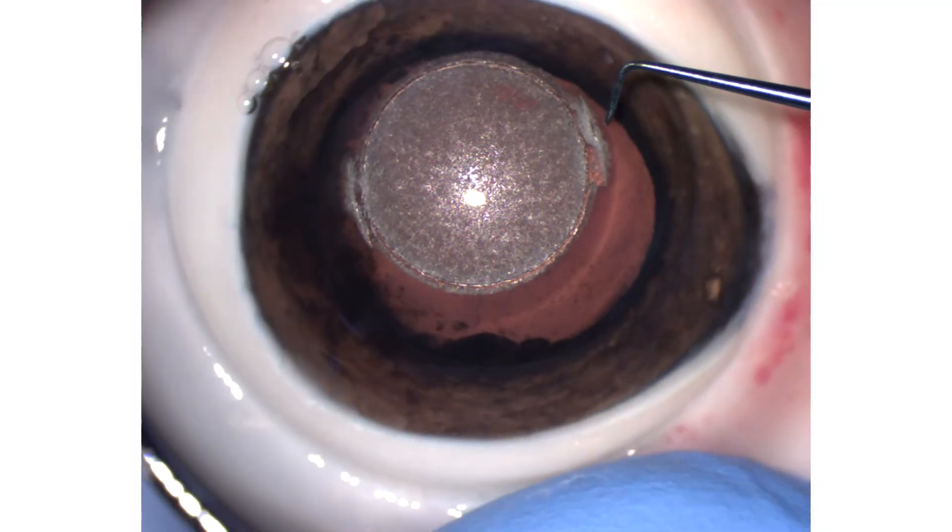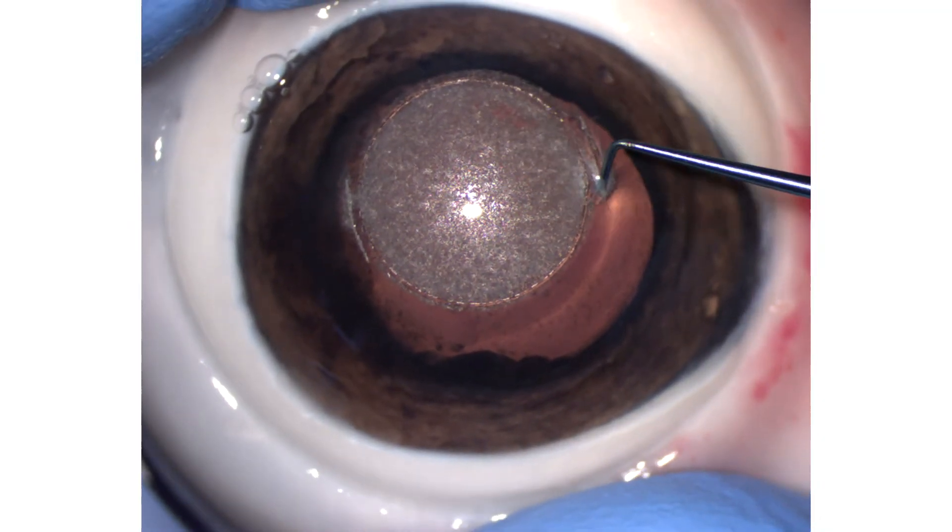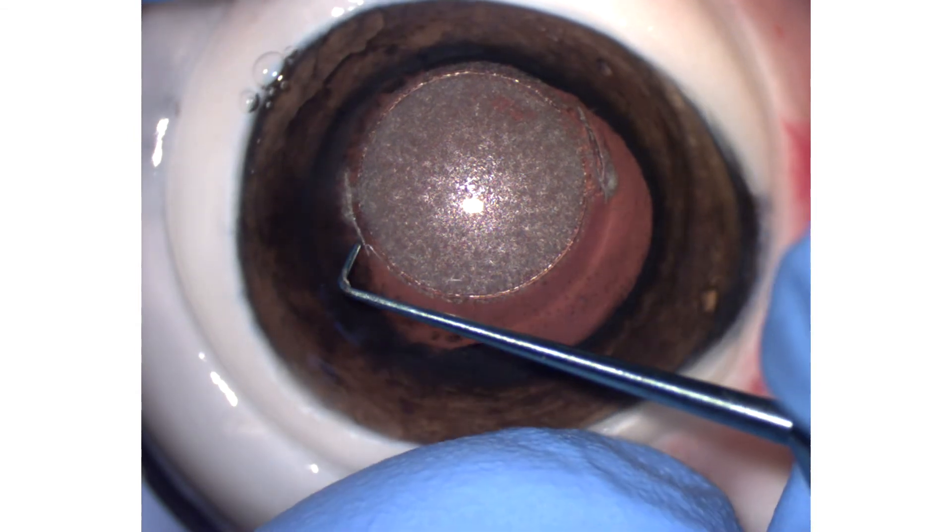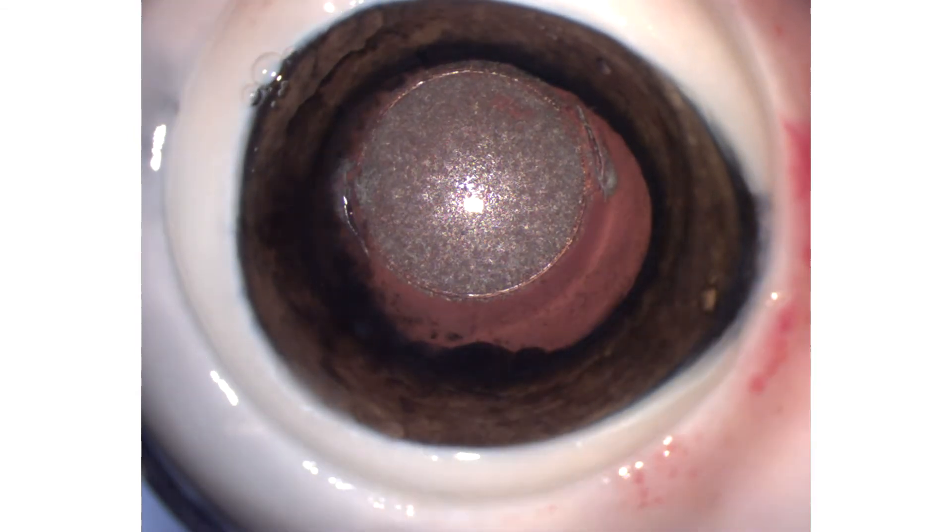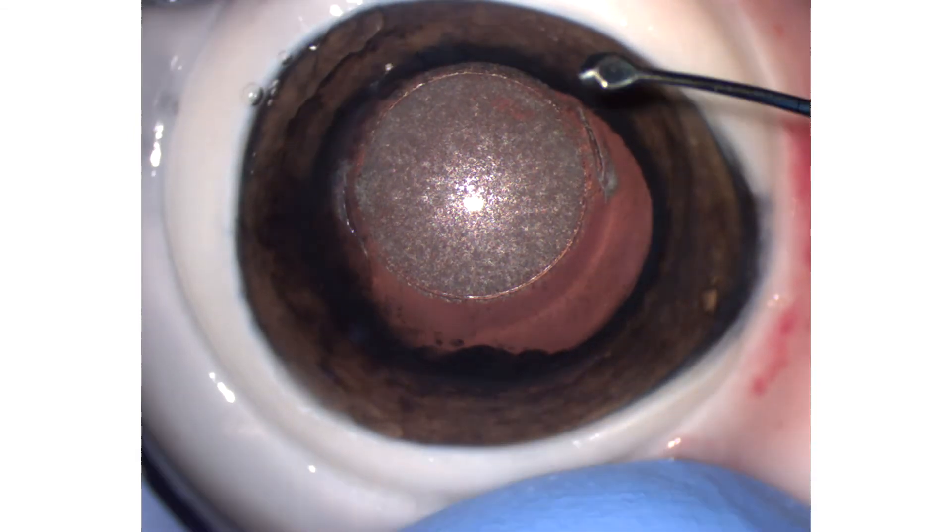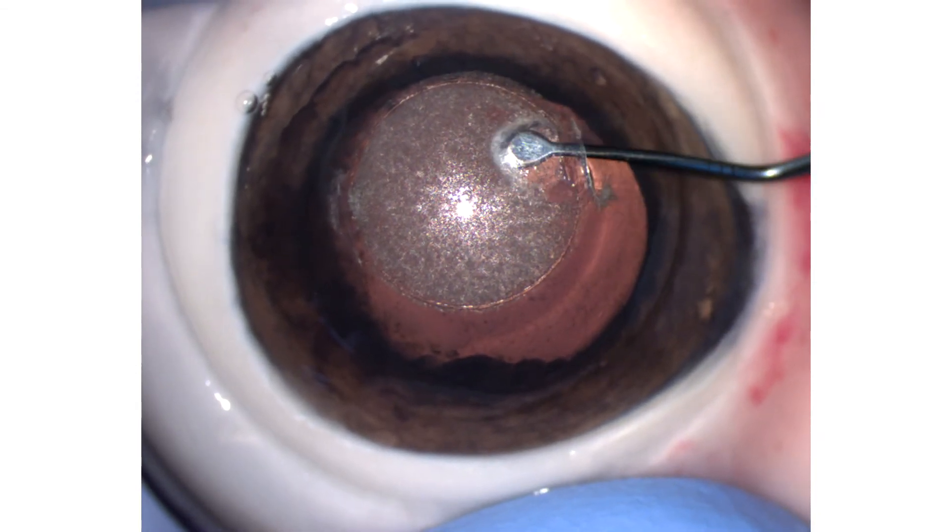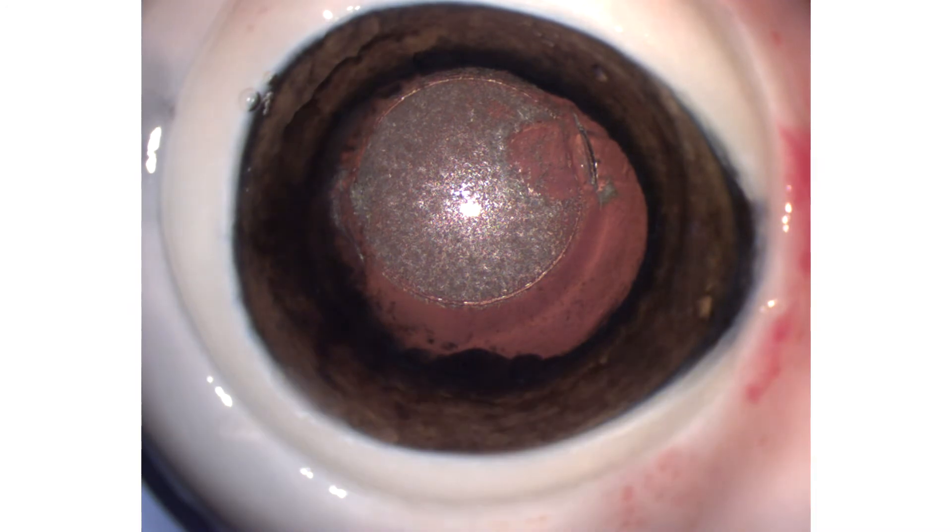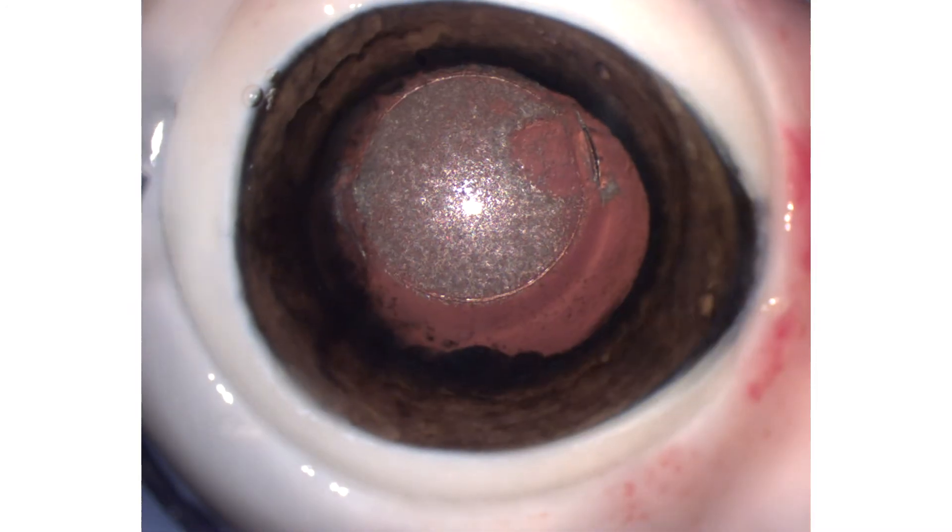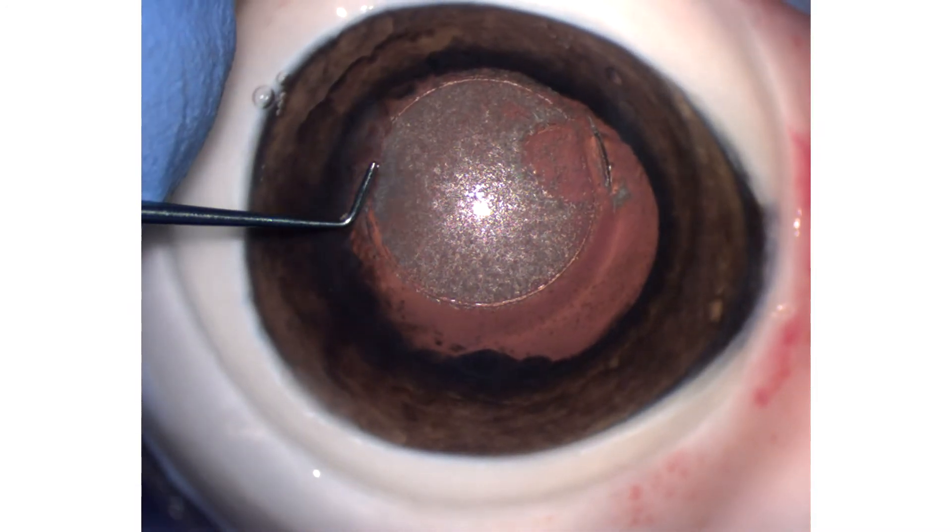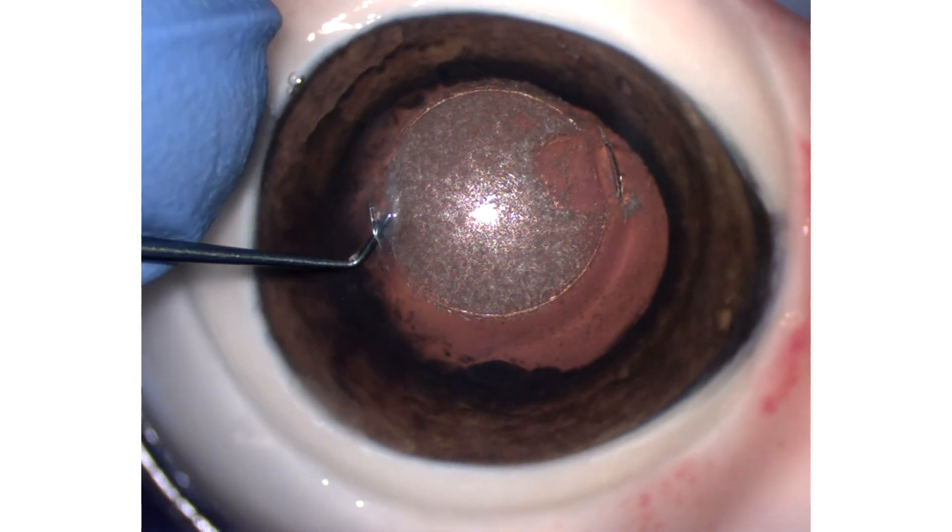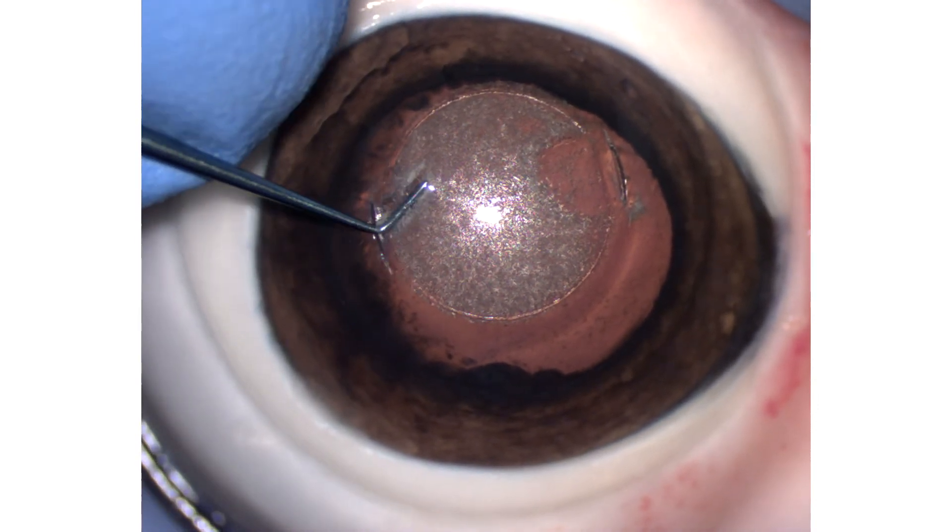Then I will open first the incision. So here I have the incision leading to the posterior plane, and here the incision leading to the anterior plane. I open a little bit each of the plane at the beginning, just a little bit on both sides, just to be sure I find them afterwards after manipulation.